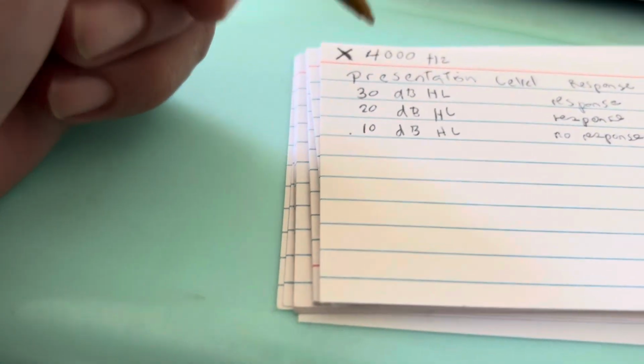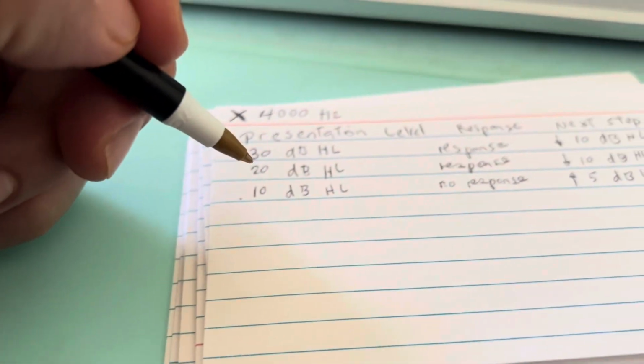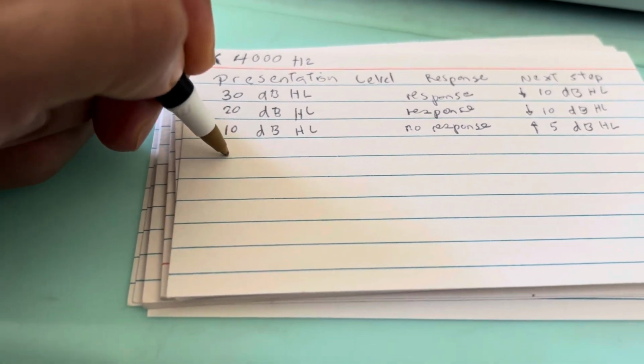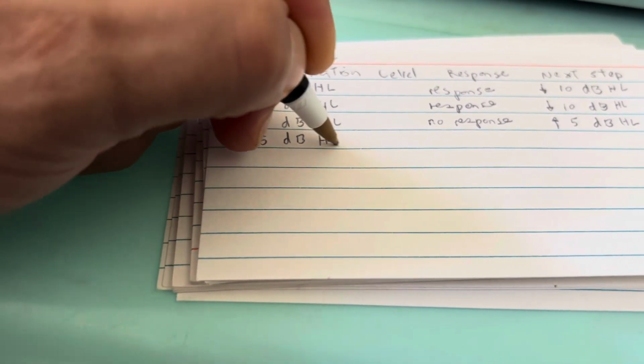If there is no response, then we have to go up 5 decibels hearing level. So we're going to go 5 decibel hearing level up. That will make it 15 decibel hearing level.